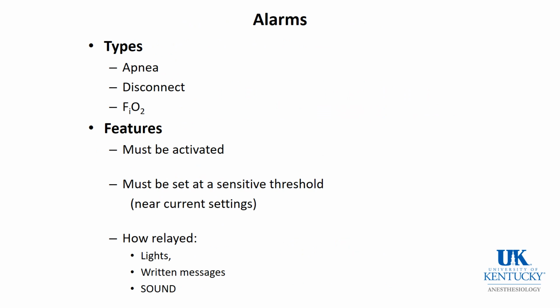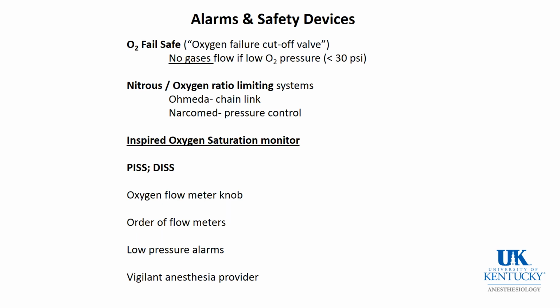There are a number of alarms on the machines: the apnea alarm, disconnect alarm, FiO2 alarms. I always emphasize that they have to be activated, they should be sensitive, and they should be displayed by lights, written messages, and sound.